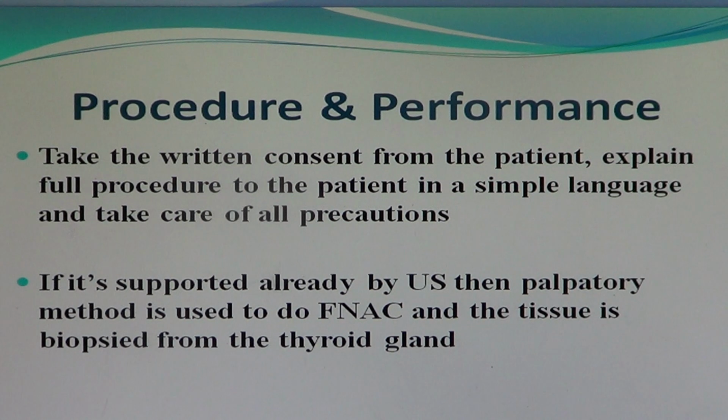We need to take written consent from the patient, explain the full procedure in patient-friendly language, and take care of all precautions. If it is supported already by ultrasound, then the palpatory method is used to do FNAC and the tissue is biopsied from the thyroid gland.